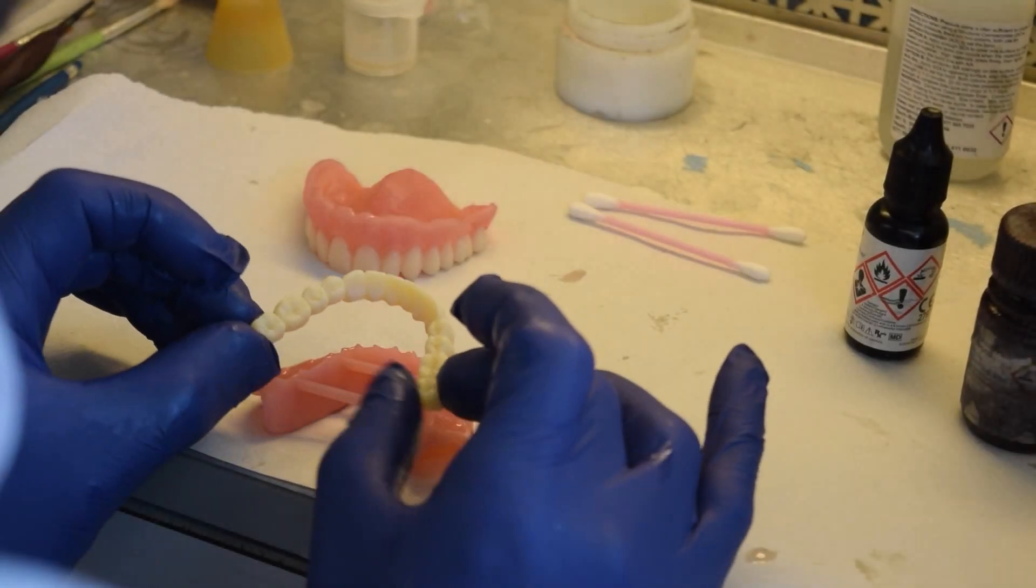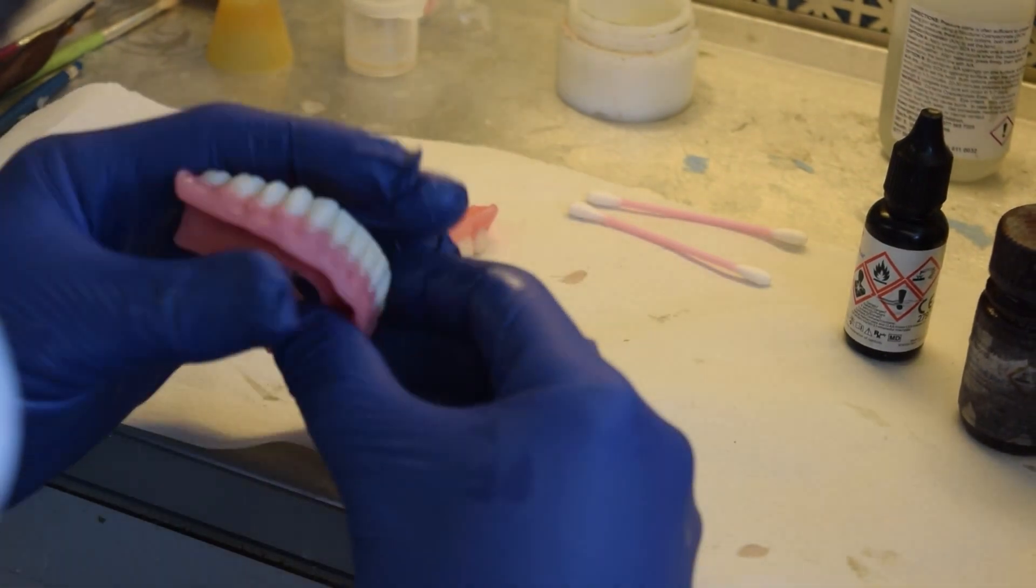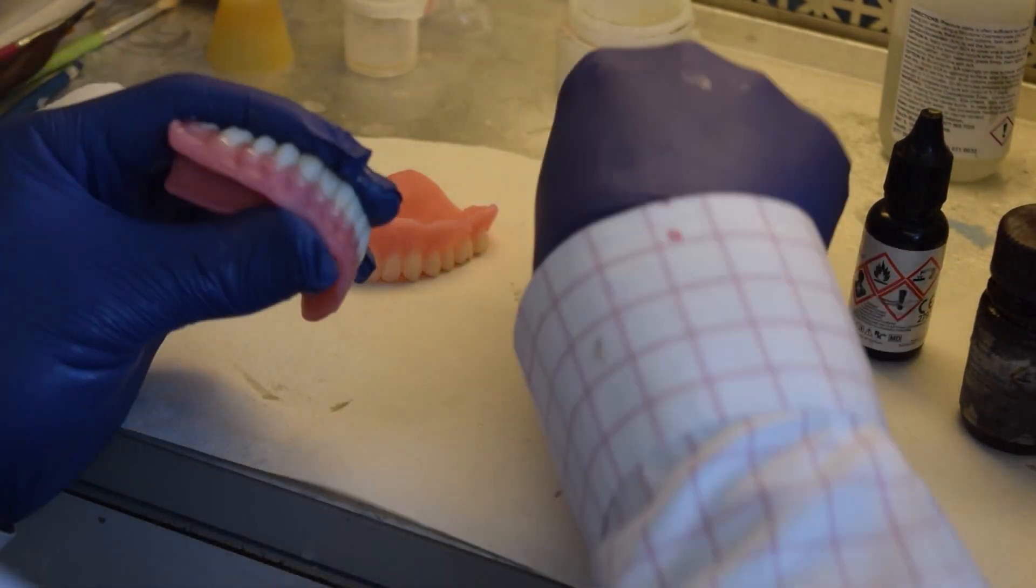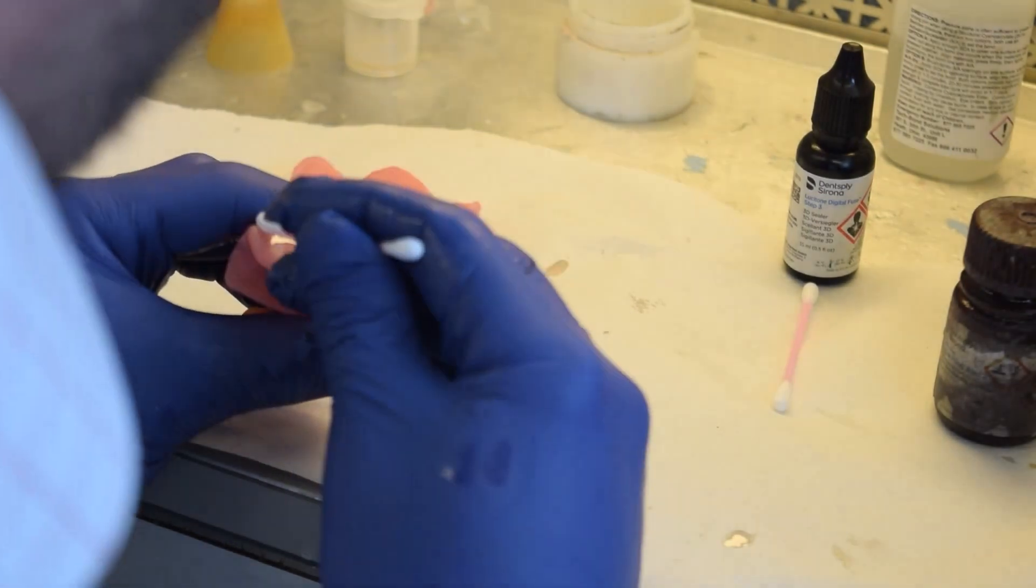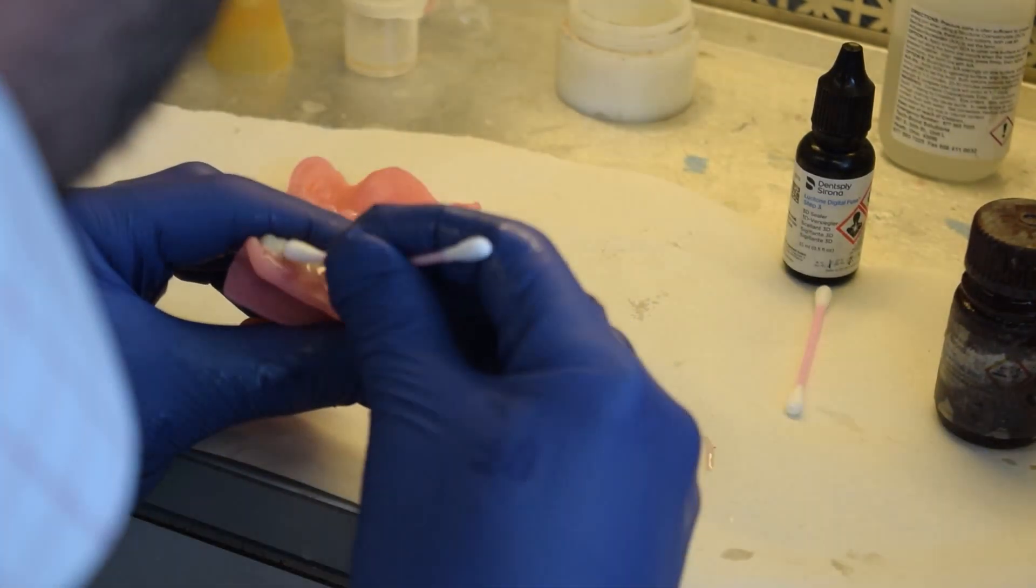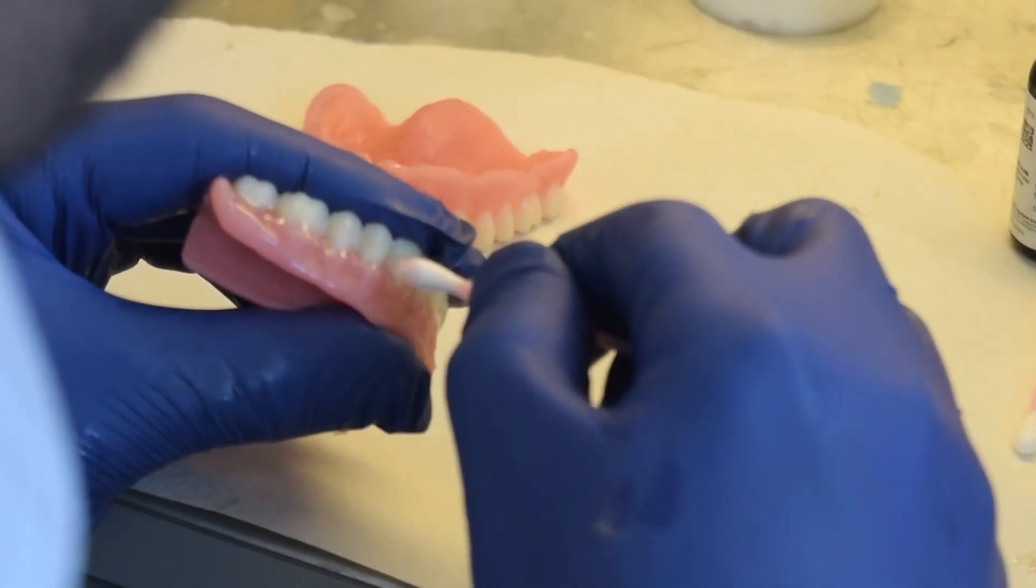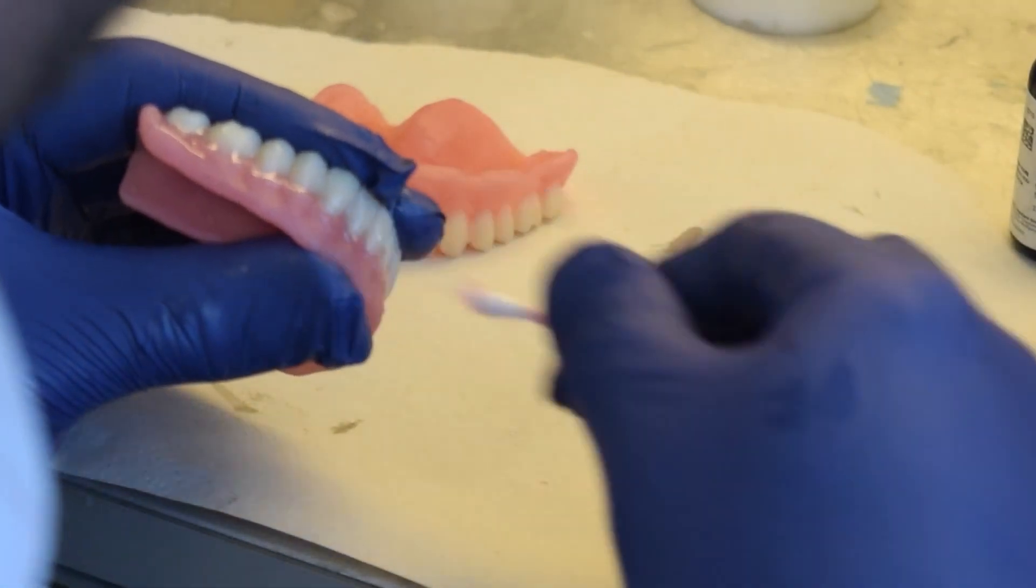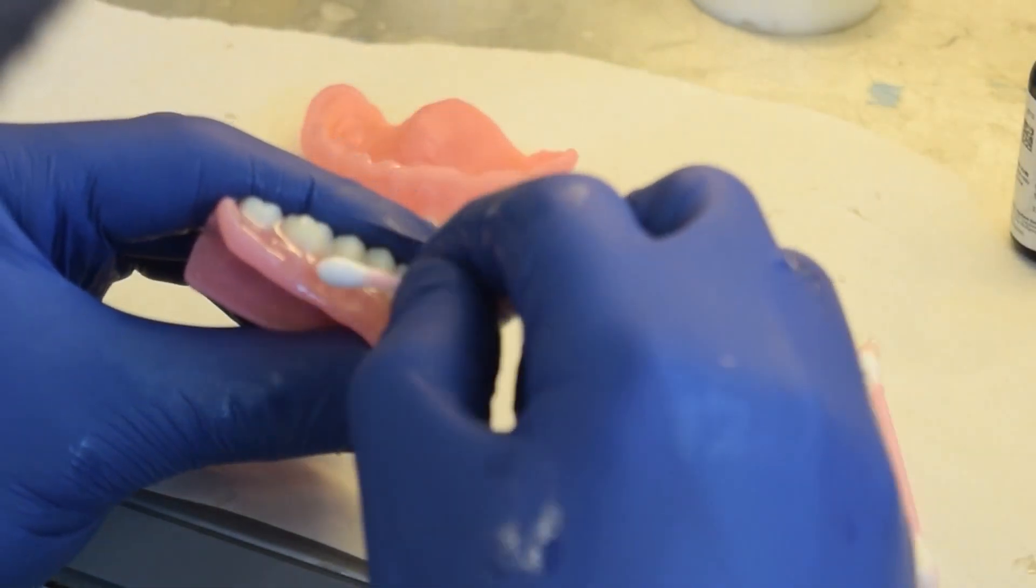The printer resin of the base and teeth is slightly different from a chemical perspective. We use Lusitone digital print resin from Dentsply for the denture base and DEMA print denture teeth resin from Kulser for the teeth. It is important to note that the denture base and denture teeth have not yet been fully cured at this point.